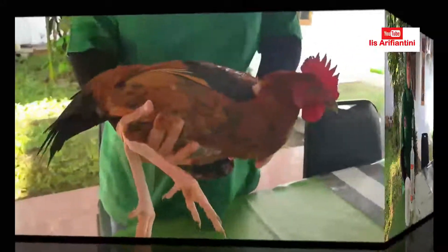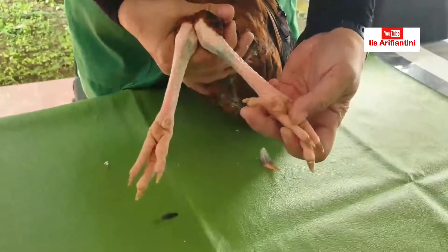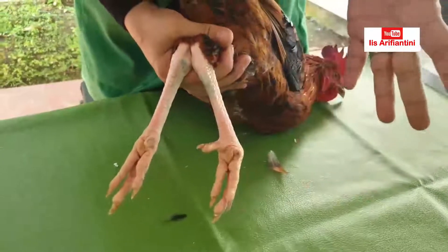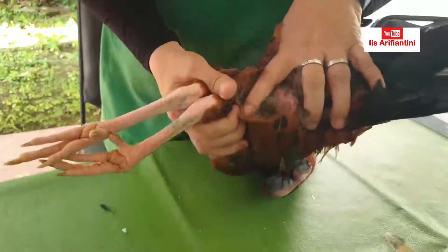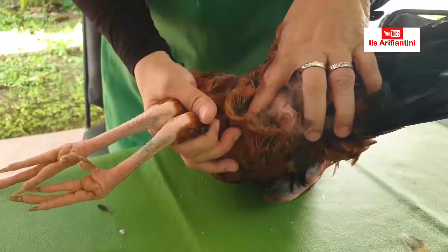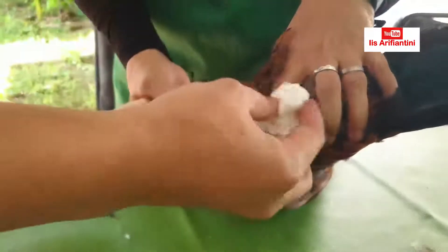Alat yang digunakan seperti ini. Kita bisa lihat dari ukuran tajinya — kalau ukuran tajinya lebih dari setengah senti, ini sudah bisa ditampung semennya. Ini kira-kira satu senti lebih, berarti sudah bisa ditampung semennya. Cara menampungnya adalah sebagai berikut: yang pertama kita bersihkan dulu kloakanya dengan NaCl fisiologis — tisu yang dikasih NaCl fisiologis kita bersihkan dulu ke kloakanya.